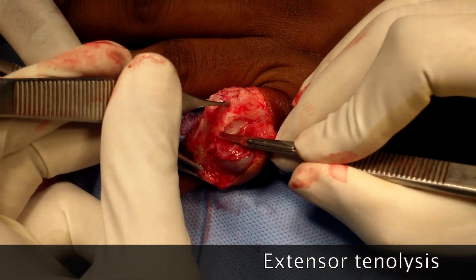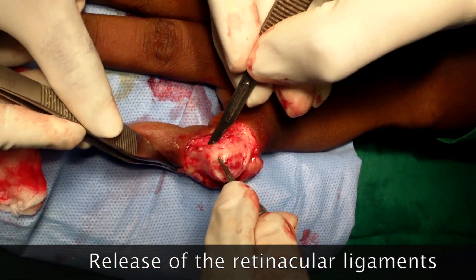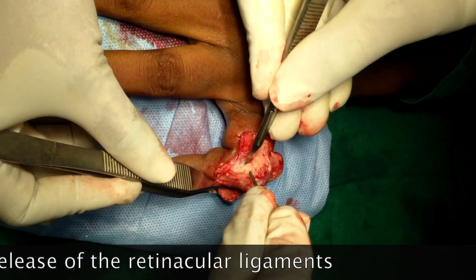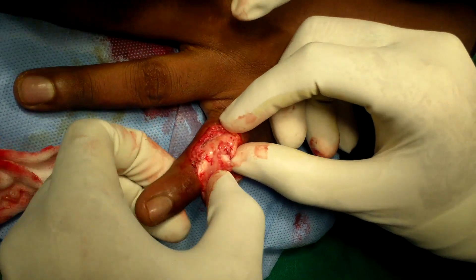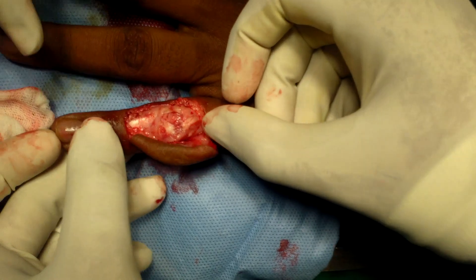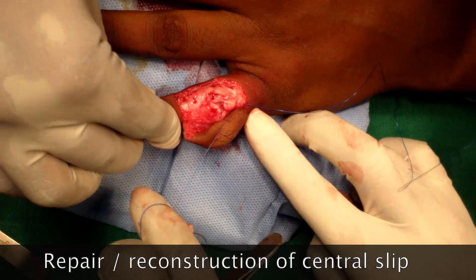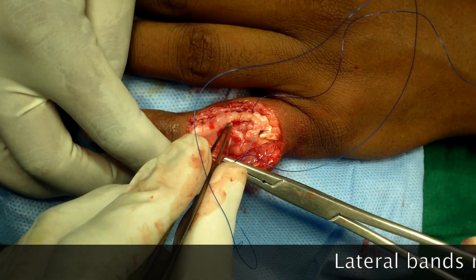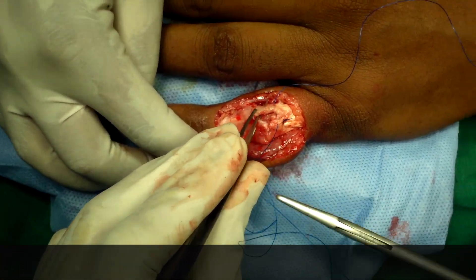Extensor tenolysis is done to release the extensor tendon and the hood from the underlying bone. The transverse retinacular ligament is then released on the radial side of the little finger, and the oblique retinacular ligament is released and excised because it is quite thick. Once this is done, we are able to extend the PIP joint passively without any restriction. The gap between the cut ends of the central slip is quite small in this patient. Primary suturing of the central slip is carried out, and passive flexion is confirmed to be completely possible. The lateral bands released on both sides are then brought to the dorsal aspect and sutured to the lateral aspect of the reconstituted central slip.